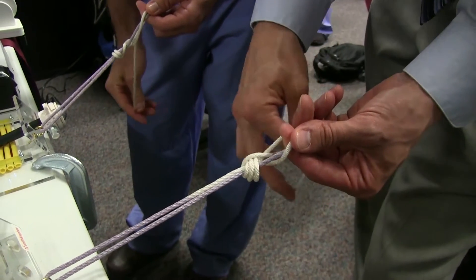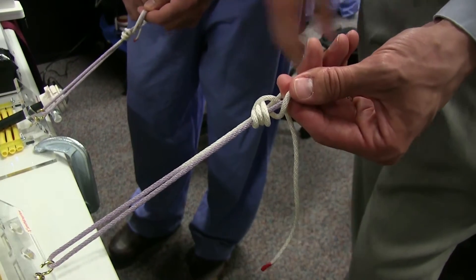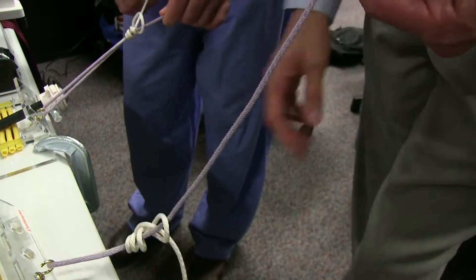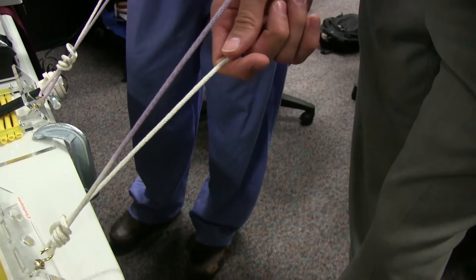Pull it down a little bit, cinch it up just a little bit, and now you can drop the other hand. Actually don't drop it, but you can just roll loose and just pull with the post.